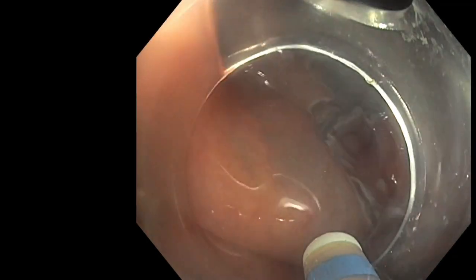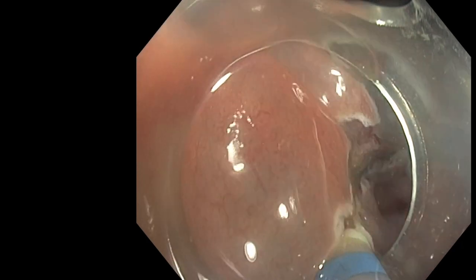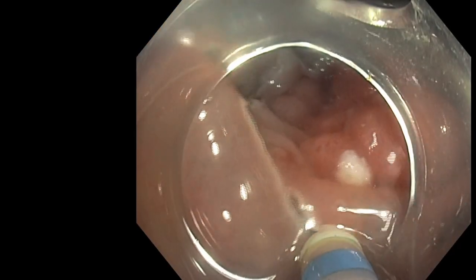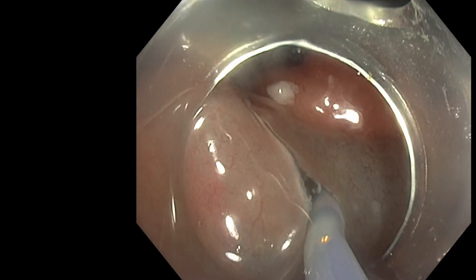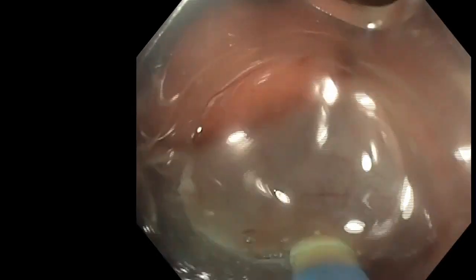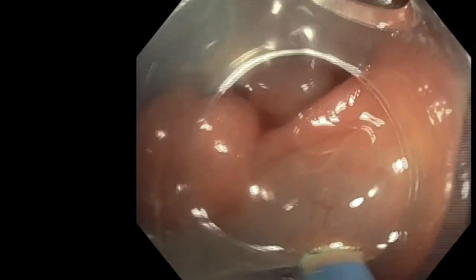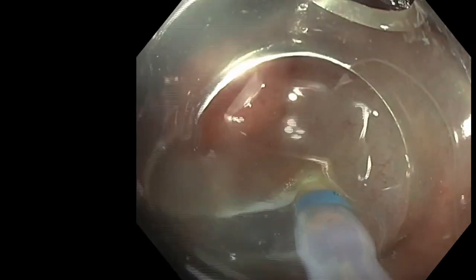So we enlarge our incision and trimming from the injected area. I don't use the needle so much after the initial injection. I try always to come back from the edge, which is already injected at the good depth, and enlarging progressively my circumferential incision.